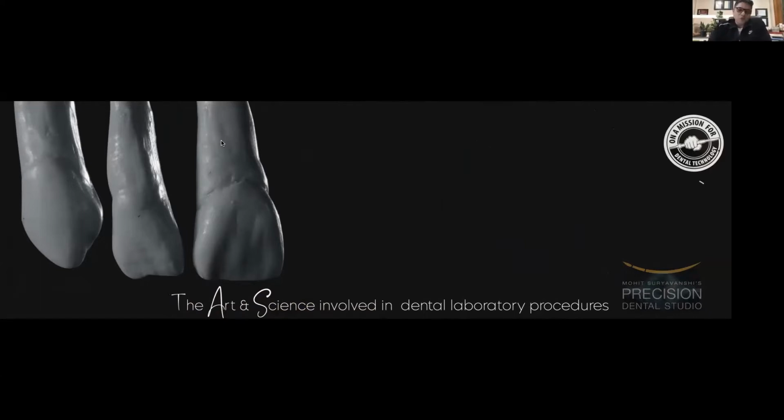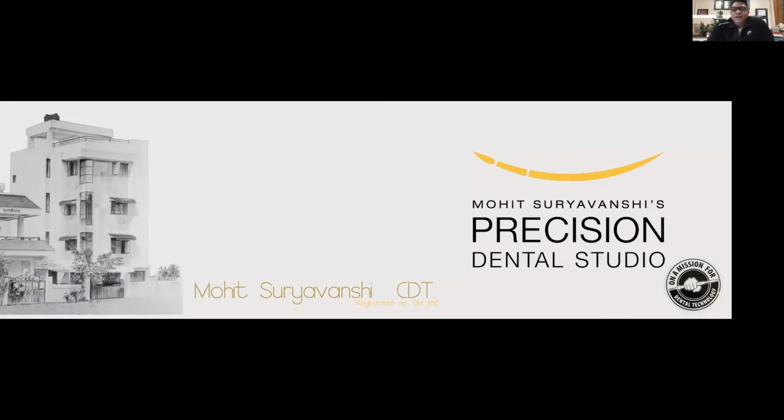So the topic for today is the art and science involved in the dental laboratory procedures. The image that you see on the left hand side is an exercise that we often do in the lab, wherein we try to mimic a natural tooth. It's a small toothpick on which we would sculpt a natural tooth. We'd like to mimic a natural tooth exactly the way it is, in the same dimensions. And that's what gives us more information about the natural tooth.